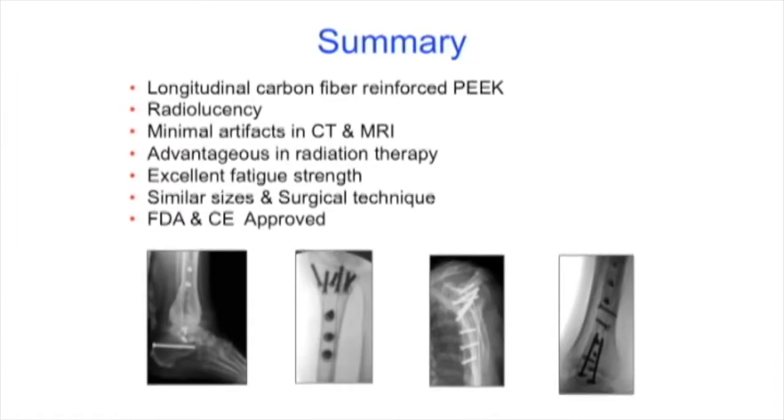Exactly. So in essence, what you can do is turn that neutralization plate into an internal-external fixator, right, and use locking screws. Because when you put the locking screws in there, you're not forcing stability based upon bone-plate opposition and friction. You're basing it on a fixed-angle implant.